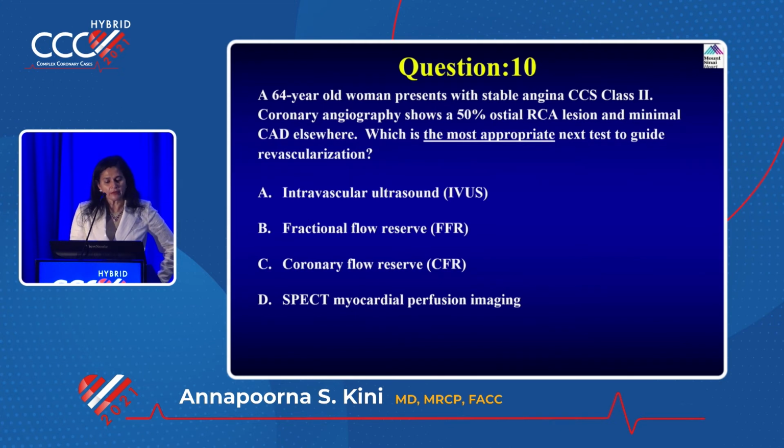The other anatomical testing, which includes IVUS, OCT, is more to understand plaque. Once you've decided you're going to do intervention and then you want to decide on technique, that's what it's for. But if you want to decide whether to intervene or not, always go for physiological testing, whether it is FFR or iFR. Not a CFR, so it is FFR.